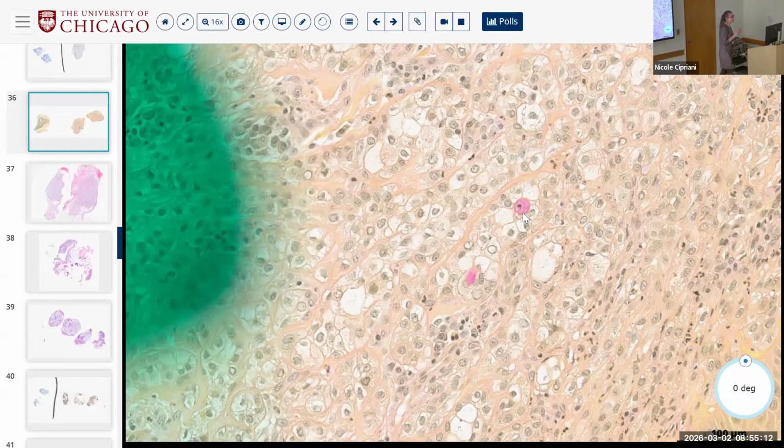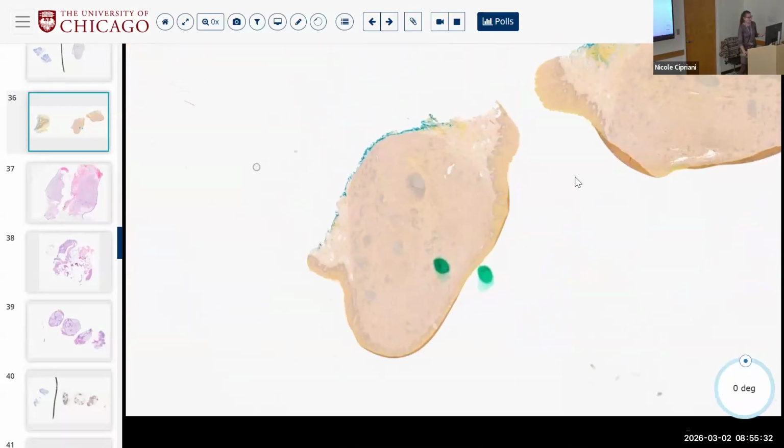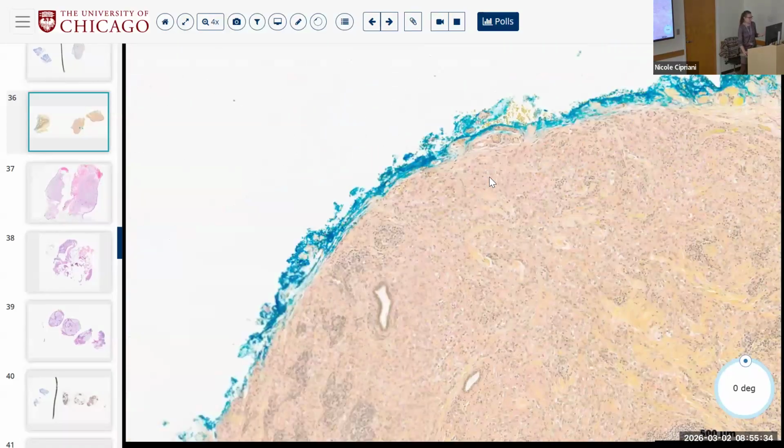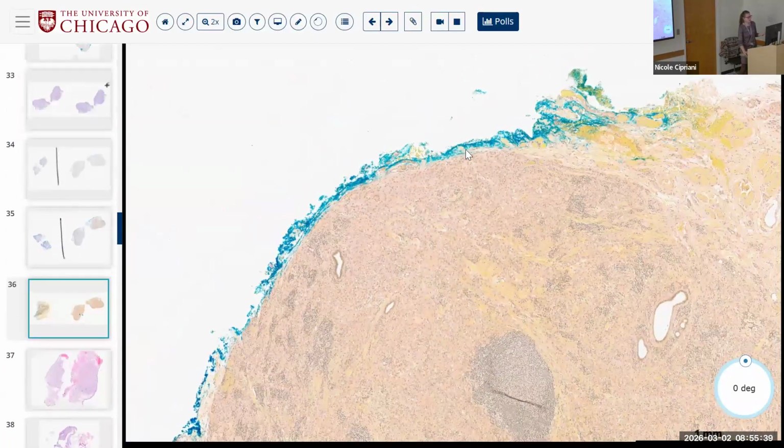All right. So this is hyalinizing clear cell carcinoma with one mucinous metaplastic cell. Excellent job though, right? This is exactly the process that we go through. Regardless, it's carcinoma. There's nothing morphologically or immunophenotypically that's benign. So we know it's at least a low-grade carcinoma that is abutting, if not present at, the deep margin. So are they going to watch it versus re-excise? Usually this close, they'll re-excise for carcinoma.